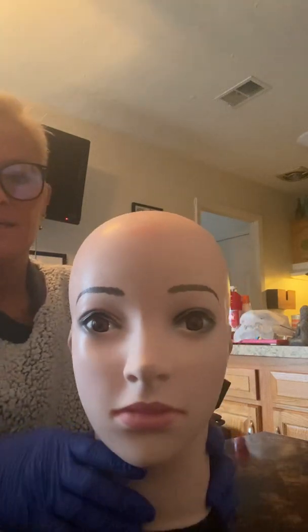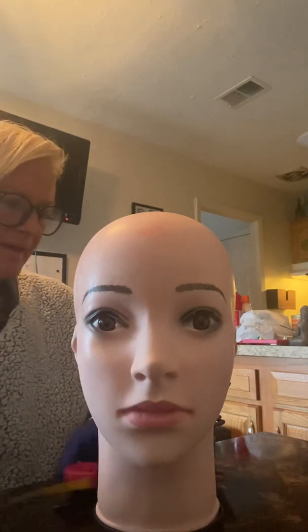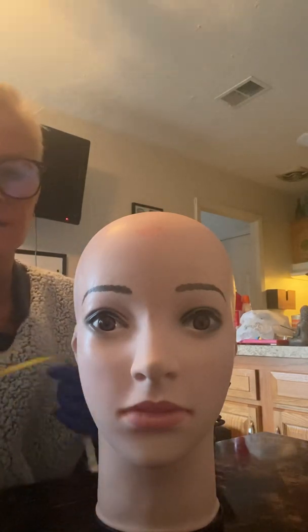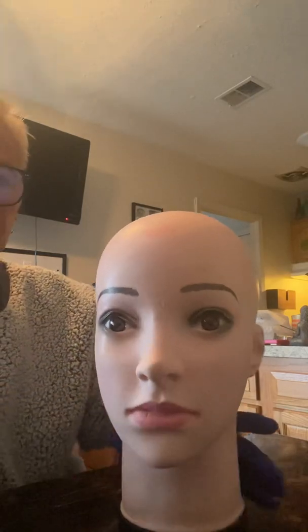Hi, my name is Lisa and today I'm going to be demonstrating measuring the head using the International 10-20 system. We're going to use a bald mannequin and first what we're going to do is locate the four anatomical landmarks.